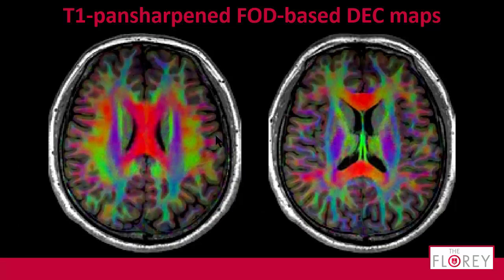Here's two actual slices. So I would say enjoy the view. Again, the fornix is quite nice. You don't get that with your diffusion resolution, but you do get it with the T1. It's simply the T1. It stays the T1. It's easy to interpret. And the colors provide nice mixtures.